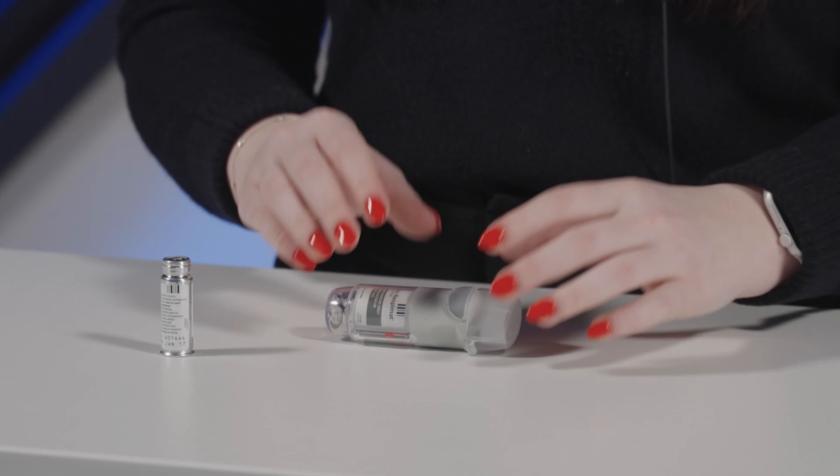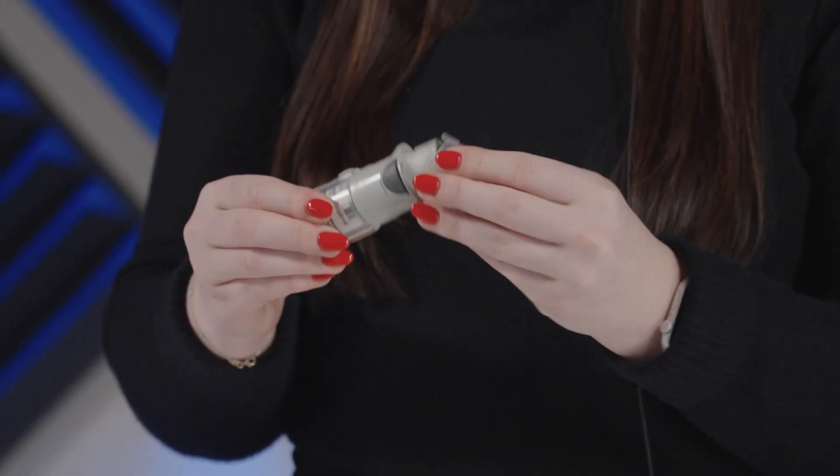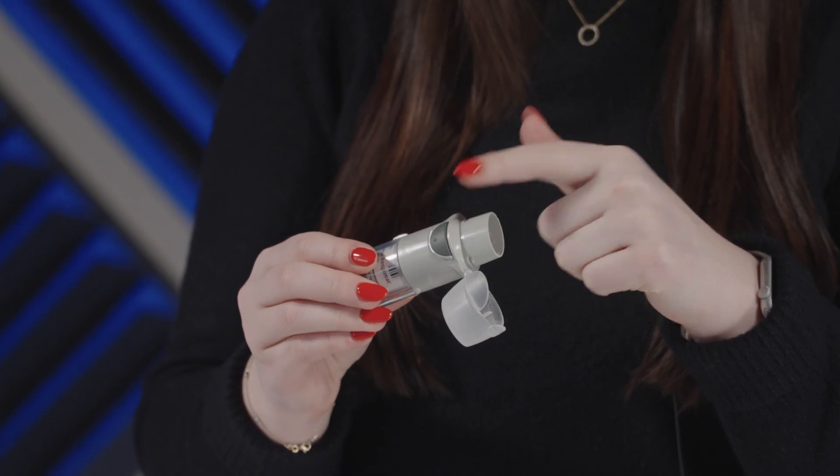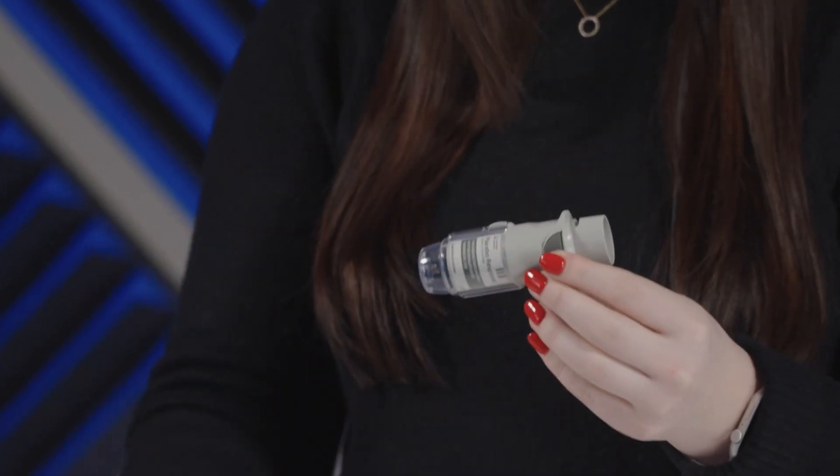For the device components, this inhaler device will contain a cap, a mouthpiece, a dose release button, a clear base, and then the cartridge.